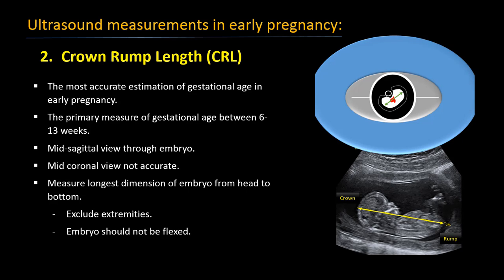As soon as the embryo can be seen, gestational age can be estimated by measuring the crown rump length. A correctly performed crown rump length measurement is the most accurate estimation of gestational age in early pregnancy; however, it can also be the most difficult measurement to obtain. Crown rump length is the primary measure of gestational age between 6 to 13 weeks. To obtain it correctly: first, obtain a mid-sagittal view through the embryo; then ensure the embryo or fetus is not flexed; measure the longest dimension from head to bottom, excluding the extremities. Any degree of flexion will produce underestimation of the crown rump length when linear calipers are used.